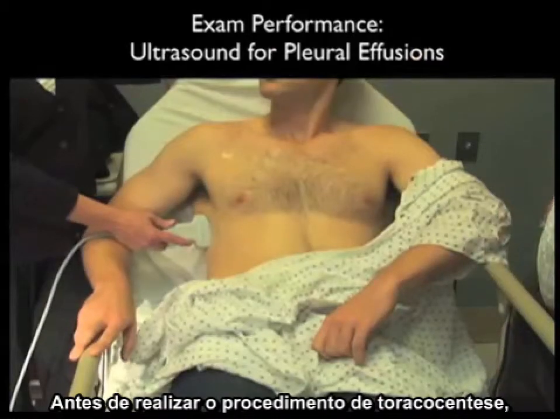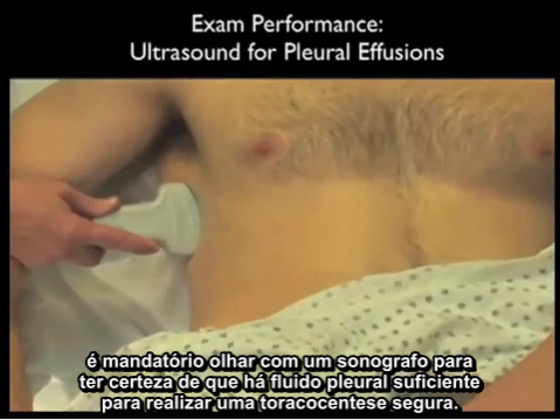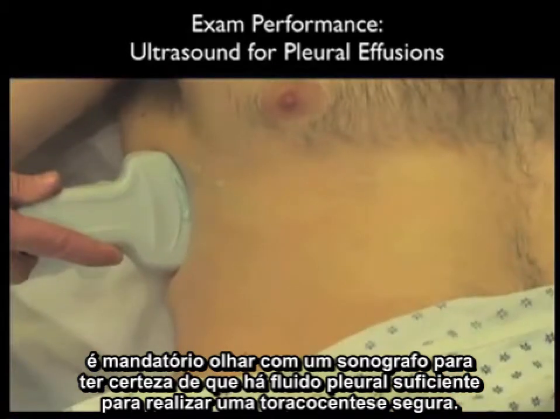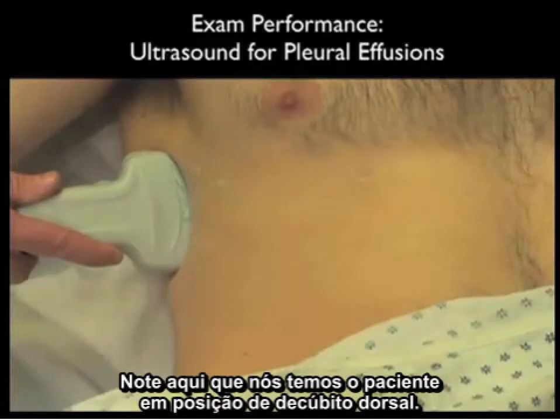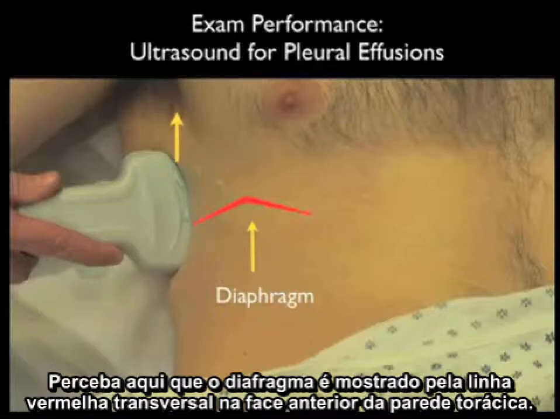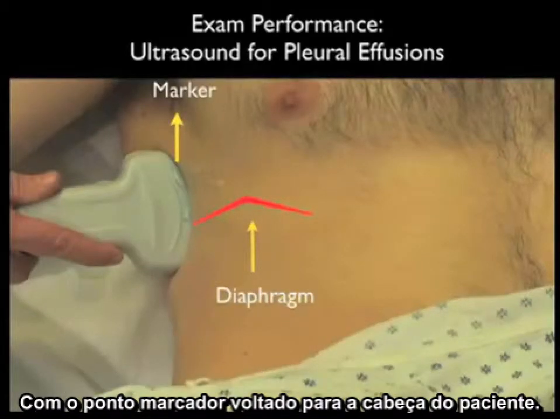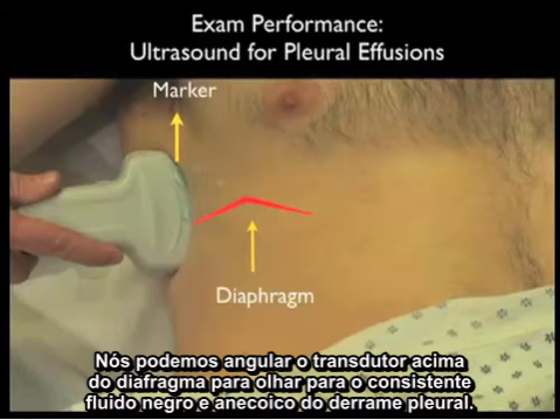Before performance of a thoracentesis procedure, it's mandatory to look with sonography to make sure there's enough pleural fluid amenable for a safe thoracentesis. Notice the patient positioned in an upright position so that the fluid will layer out above the level of the diaphragm. We note the diaphragm as shown by the red line across the patient's anterior chest wall. The probe is positioned along the lateral aspect of the patient's chest with the marker dot towards the patient's head. We can angle the probe above the diaphragm to look for a dark or anechoic collection of fluid consistent with the pleural effusion.